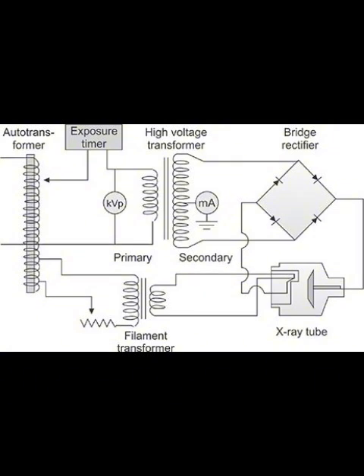Let's start with phase. You often hear about single-phase versus three-phase power, especially with bigger equipment. Right, like in industrial settings. Exactly. Single-phase power, like typical house power, is less efficient for something like an X-ray machine because the voltage actually drops all the way down to zero between each cycle. A little power dip, 120 times a second. Yeah, imagine trying to drive a car that keeps losing all power for a split second, over and over.